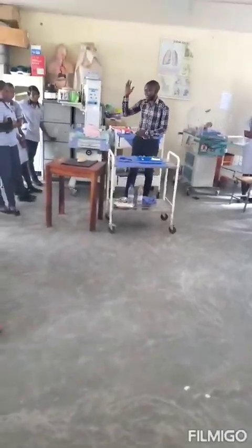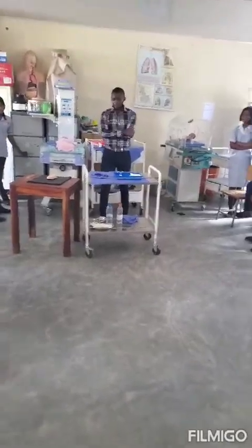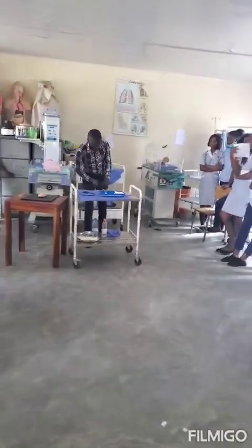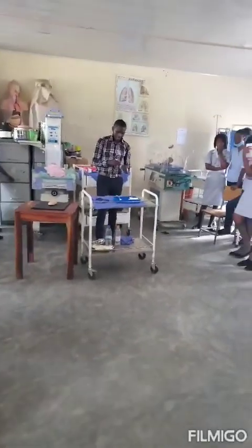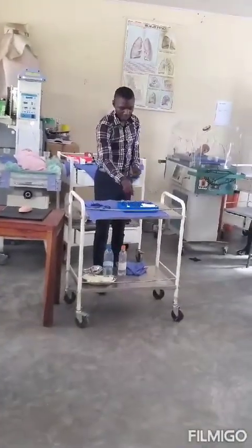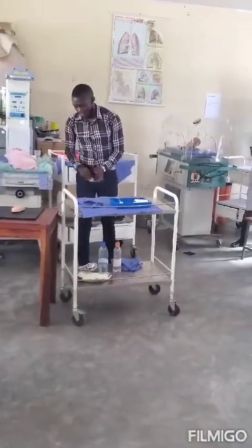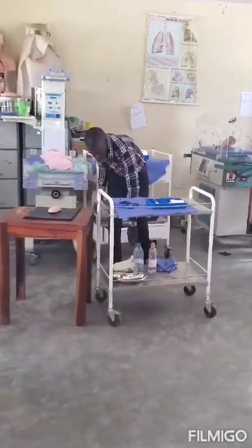So let's say the scenario reads, Mr. X was brought into the medical ward after sustaining a wound on the right thigh. Thus, perform suturing in 5 minutes to close up the exposed wound.